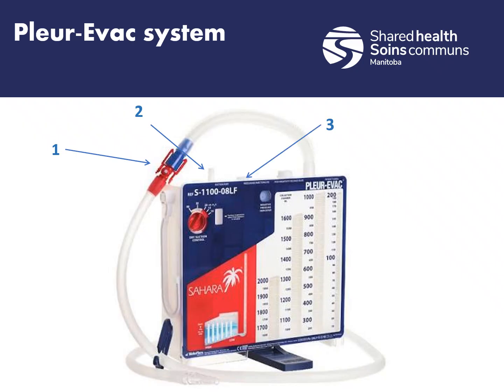Also on the top of this device, we have a fluid injection port for the air leak meter. As you can see at the bottom, there's that blue fluid in the leak meter. They don't always put fluid into these all the time. Sometimes it's just air, but most of the time there is fluid, but either way it works. If you do need to inject fluid into this device, you would take the syringe off the back of the device and put the fluid in through the top here.